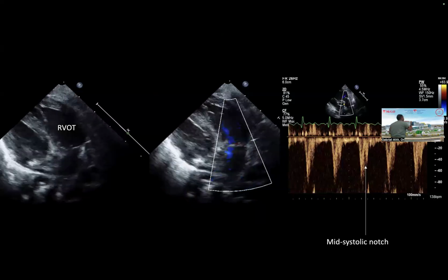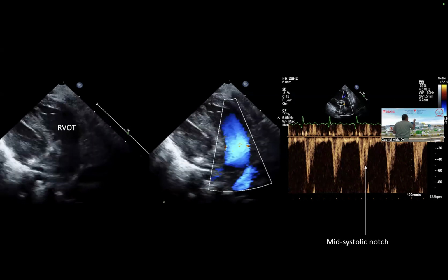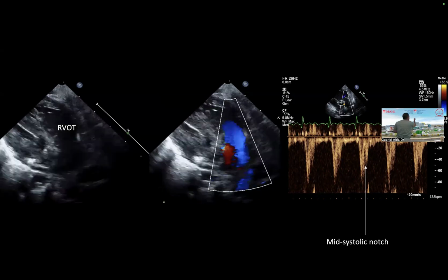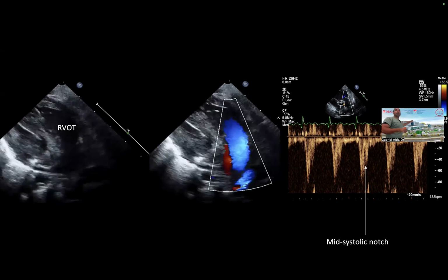Let's say your RV is like this, and you have your valve open. And this is the tricuspid valve. This tricuspid valve is closed because the blood flow is going this way. First, the blood flow is trying to go this way, but here it's very blocked. So your initial flow may go and balloon here. So when this recoils, it goes back like this. Oh, I see. It still pushes in the right direction. It still pushes forward because the RV is still contracting. So it's not going to go backward because your pulmonary valve is still open.